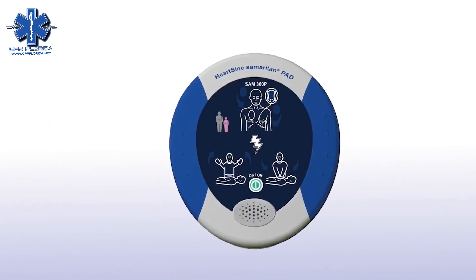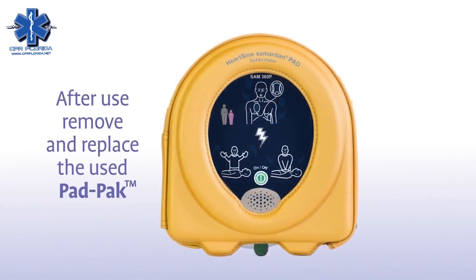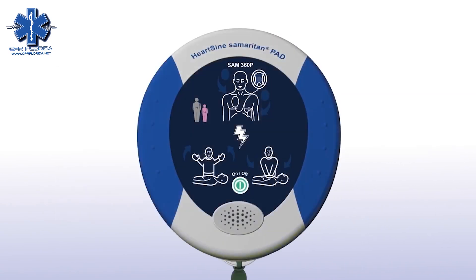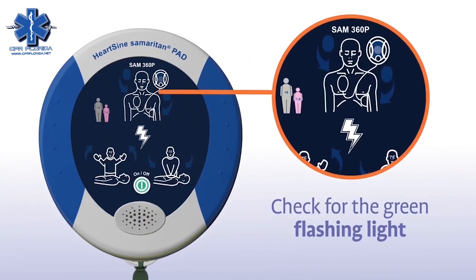After using the Samaritan PAD, slide a new pad pack into the unit and store it as usual. Remember to follow your local battery disposal guidelines. Once a week, check that the green light is flashing so you know the unit is ready in case of an emergency.